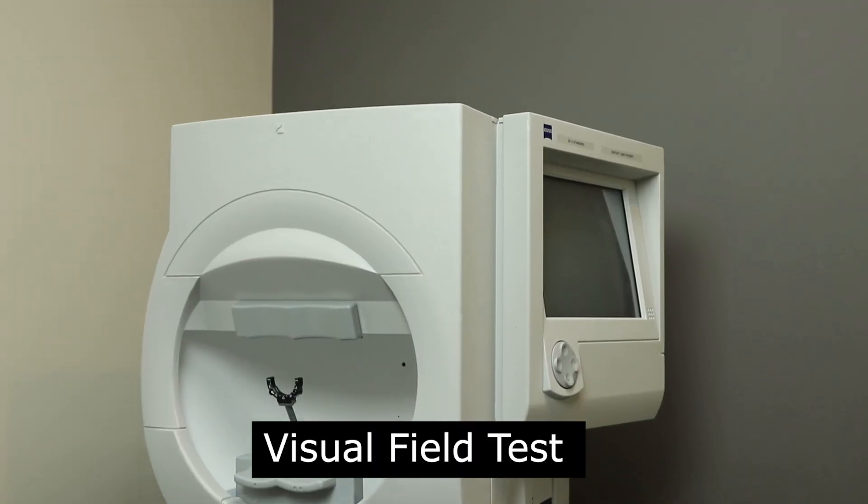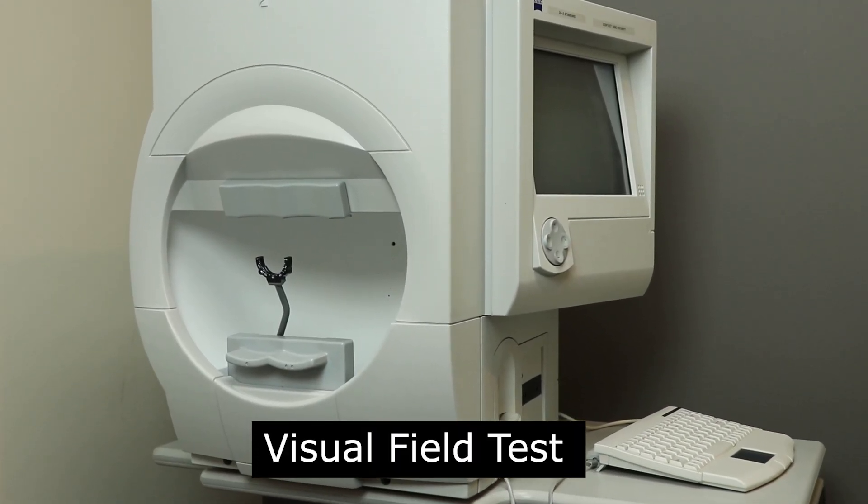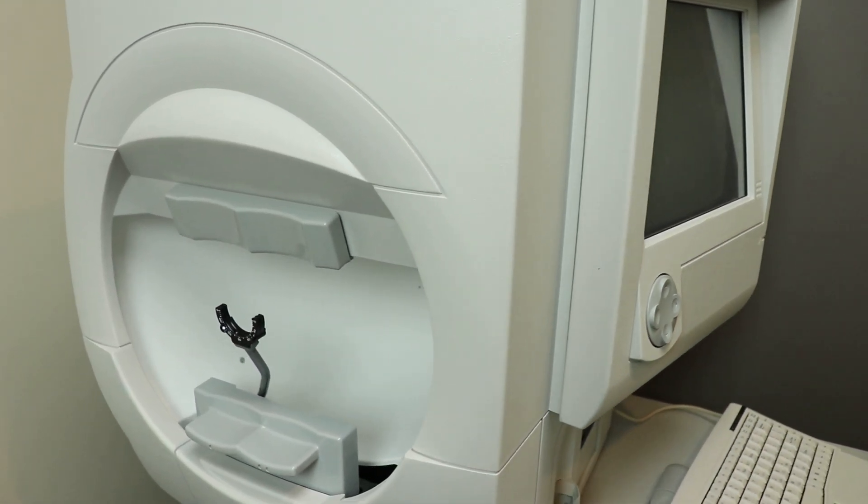Another instrument you'll most likely see at any doctor's office for glaucoma is the automated visual field analyzer. This instrument is really important because glaucoma can cause loss of peripheral side vision. It helps map out whether any functional vision loss has occurred, and it allows the doctor to stage the severity of the disease and monitor for progression.